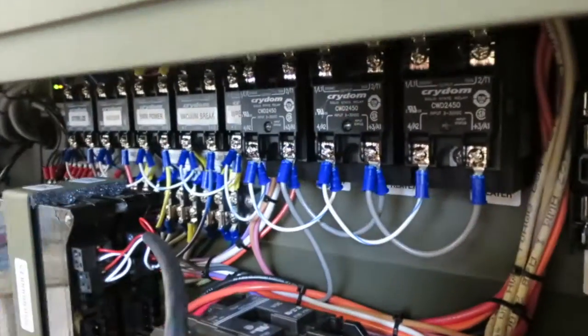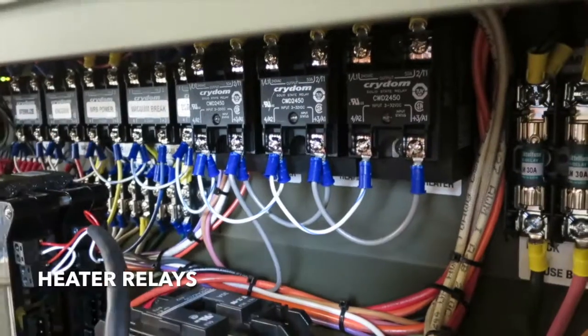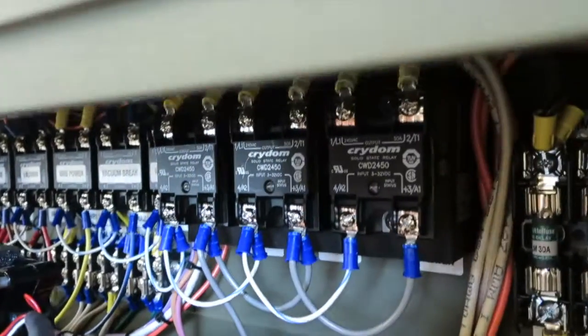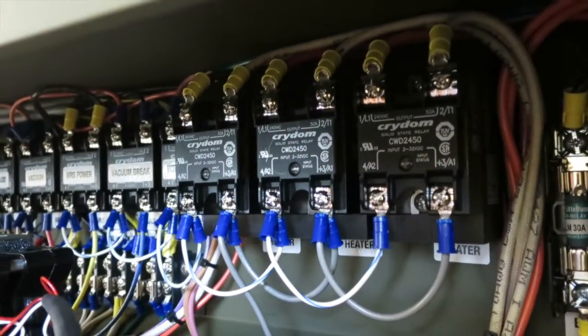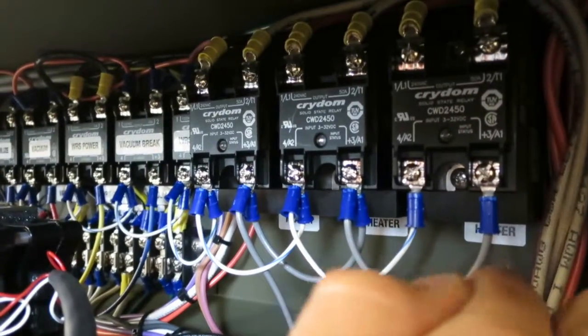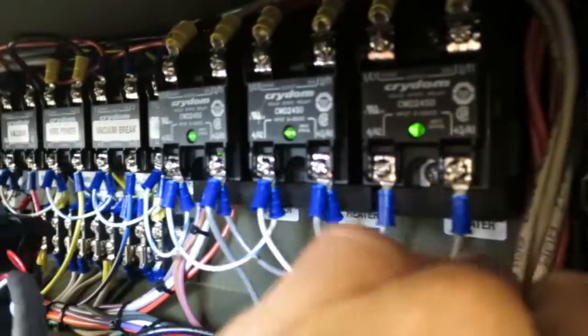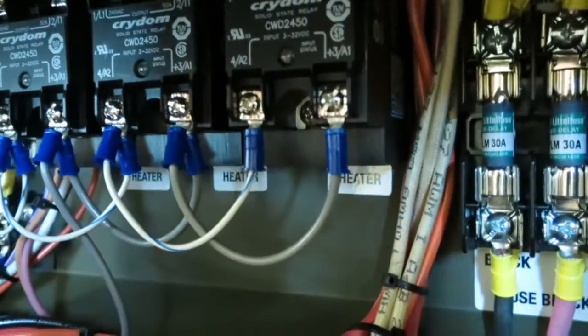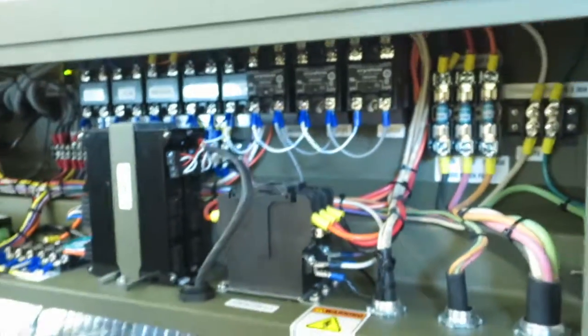Right here, these 3 relays, very important relays here. We got 3 because each one corresponds to a heater element. Remember I was talking about the heater element wires down here. Those connect to the top of those 3 relays. And you can see those LEDs that were just blinking. Those are blinking because every time the PLC says to turn on the heater elements, it's supplying 24 volts across the bottom through this gray wire. And it's firing those relays, which is connecting the circuit across the top and allowing power to flow down to the heater elements. You'll notice they're mounted on pretty big heat sinks. That's to keep them cool during operation because they're firing very often, and that allows them to stay cool and not overheat.